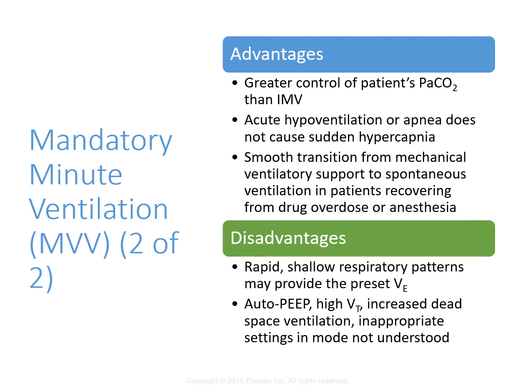If it sees that minute ventilation, it doesn't know that they're breathing fast unless you set that alarm tight, right? And that they're breathing shallow unless you set that alarm tight, right? So be aware that carbon dioxide production could increase if they have more dead space. The patient could work hard to breathe, and that could set their days on the ventilator back, right? We can cause a lot longer stays on the ventilator if we don't give them the appropriate support. So their breathing pattern and gas exchange can vary, so you need to watch them closely in this mode.